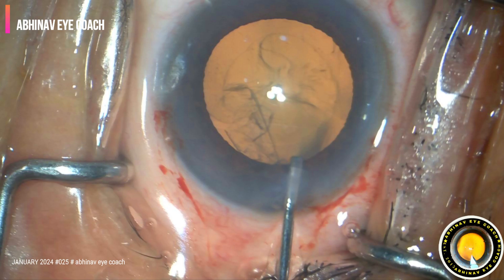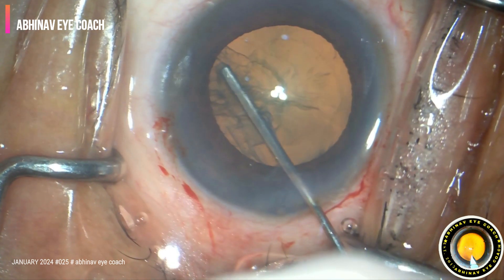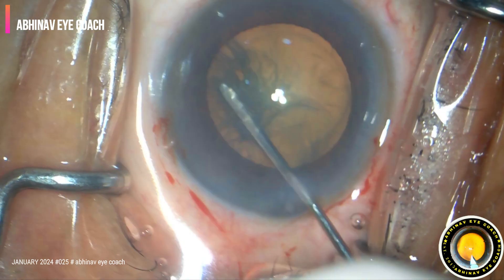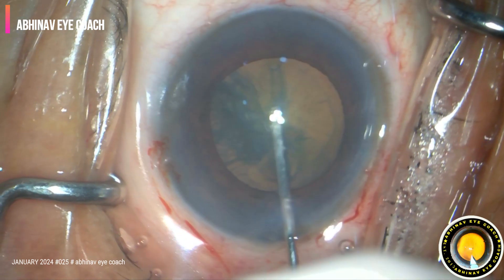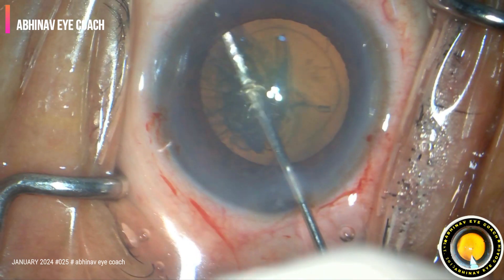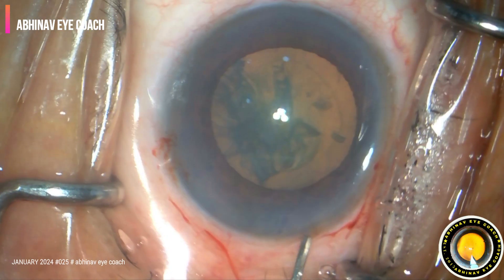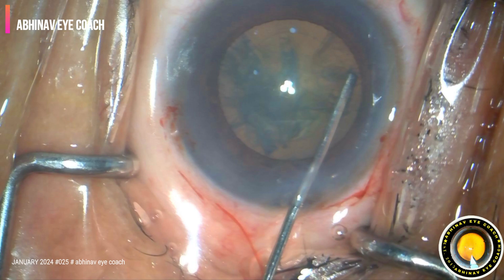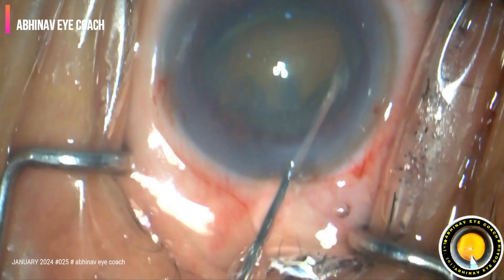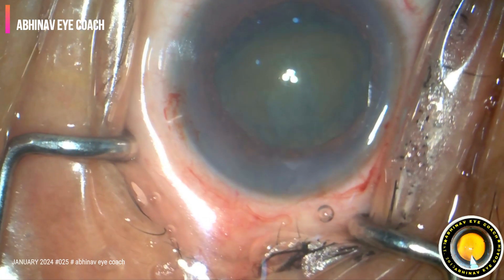Hydrodissection is done with continuous flow of fluid underneath the anterior capsular margin of the rhexis, until one pole of the nucleus is prolapsed outside the bag. Attempted from the other side, and we are going to perform the flip and chop technique.